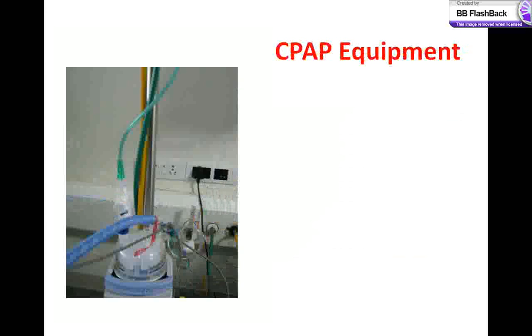Now when the gas is going into the humidifier chamber, the gas which exits from the humidifier chamber is at a relative humidity of 100% and at a temperature of 37 degrees. This gas, while it goes to the patient, gets heated to 39 degrees with a fall in relative humidity in the inspiratory limb. But by the time the gas reaches the patient, it comes back to a temperature of 37 with a relative humidity of 100%, and this is the function of a servo humidifier.